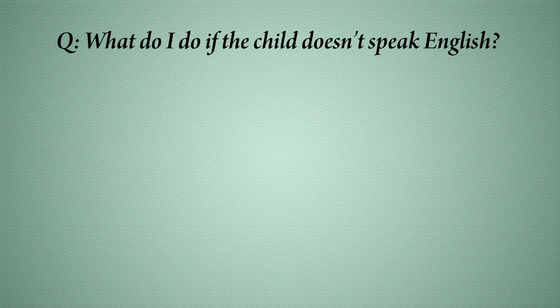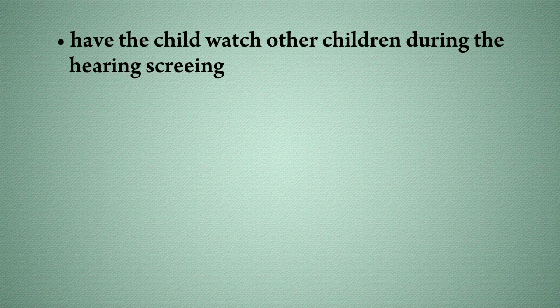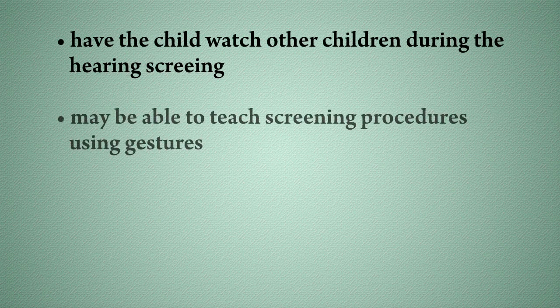What do I do if the child doesn't speak English? If the child does not speak English, have the child watch other children during the hearing screening. You may also be able to teach the screening procedures using gestures.